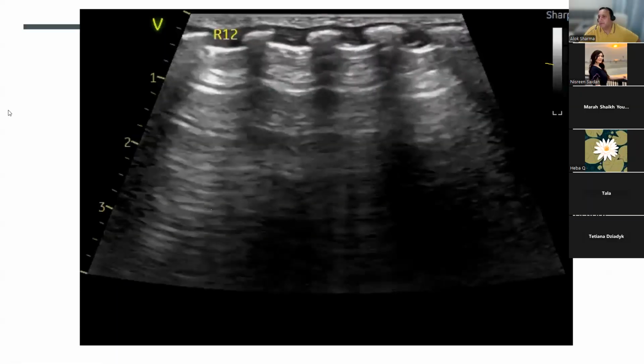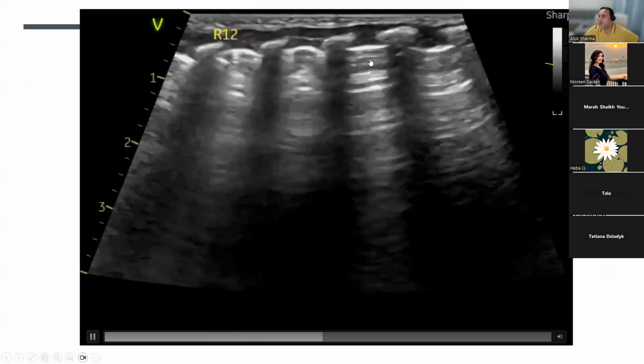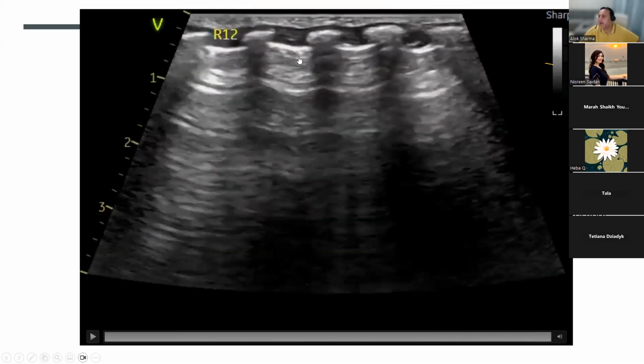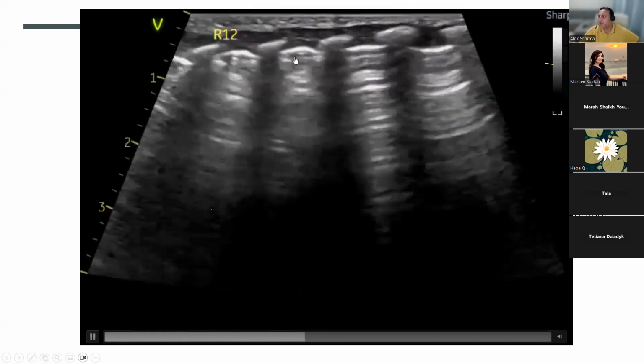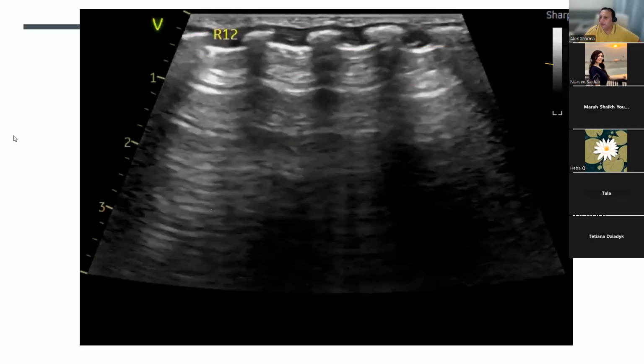Ribs, so again, just batwing sign, batwing sign, batwing sign. So this is all lung. This is a generous footprint. One, two, three, four, nearly five ribs. One, two, three, four intercostal spaces. And really, from my perspective, I've got pleura. It's sliding. It's moving side to side. I can see these small triangles at the bottom. They move from side to side. So there's clear sliding.